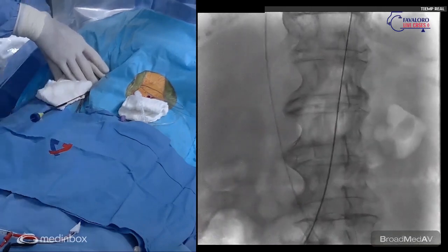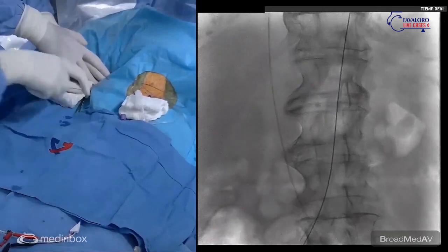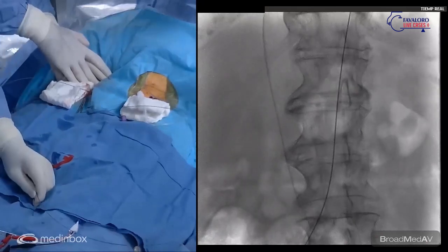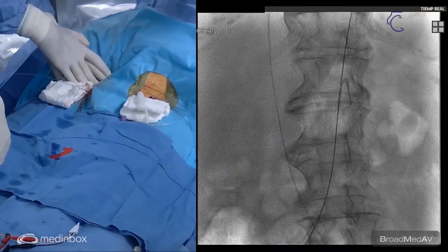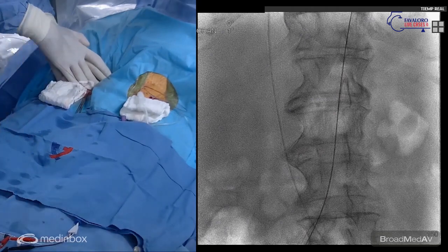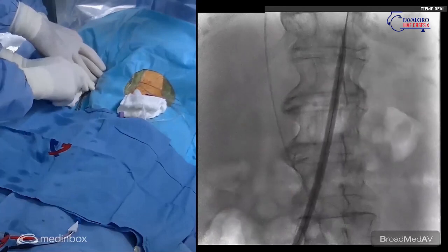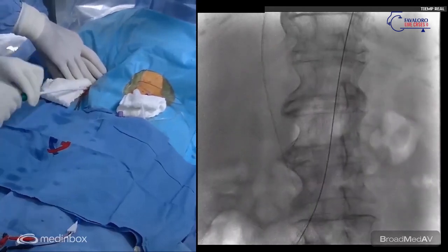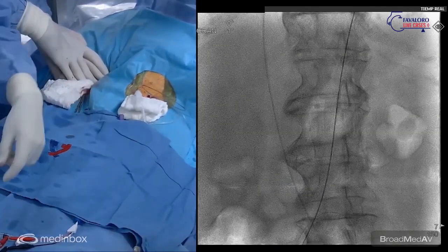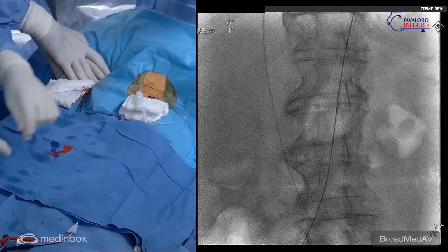It's also important, I think, when we are doing live cases where we have to wait for some time, to have a smaller sheath so we don't produce ischemia. Yeah, exactly. And also this expandable sheath doesn't have the same sealing as any other introducer. So it's good to have it to implant the valve, but not for a long time. Okay. So we have dilated the skin and the orifice. And now we put the introducer, and Fernando also recommended that we suture it, I mean, fix it.